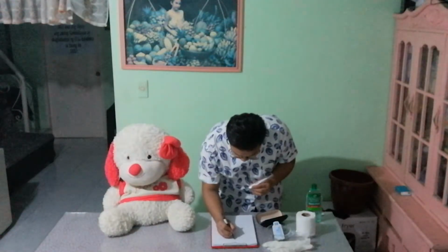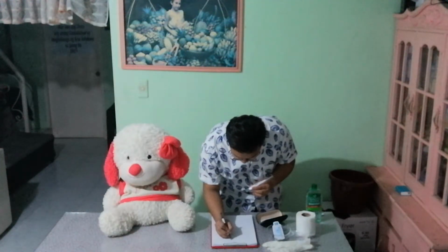Let us imagine that we have already heard the beep. After that, we need to note the temperature. Ma'am, you have a 36.4 degrees Celsius body temperature, and that is within the normal range.